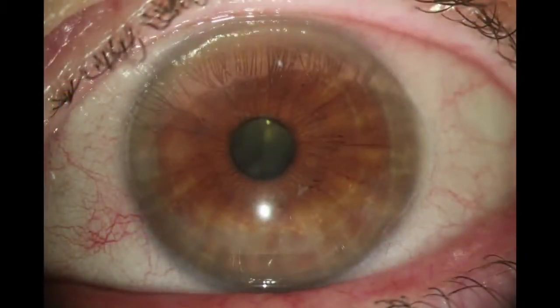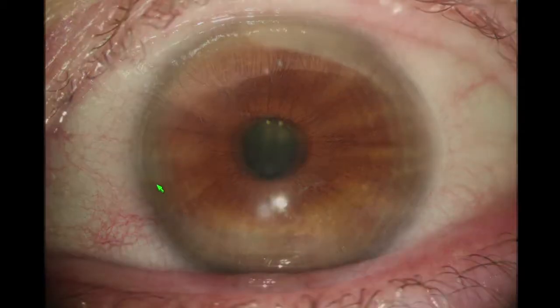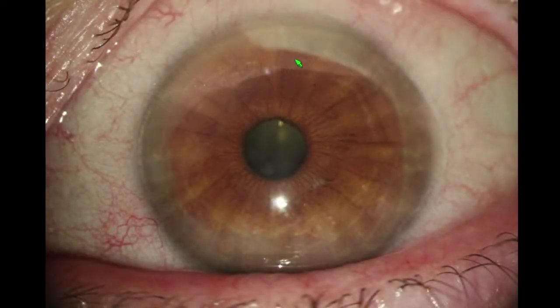What about this patient, though? There's a patient of mine who I saw within the last year. This is on her pre-op examination. Cornea looks pretty good. If we lift up that lid to remove the shadow of the upper lid, that's a cotton tip reflection. Cornea is clear. My point here is that broad illumination, diffuse illumination, is not sufficient to pick up corneal pathology on the preoperative examination. You must use oblique illumination.